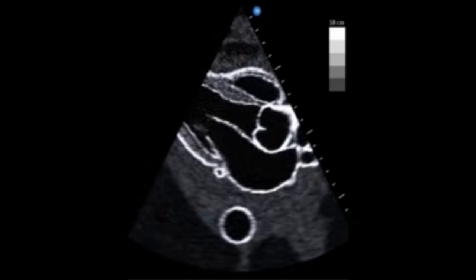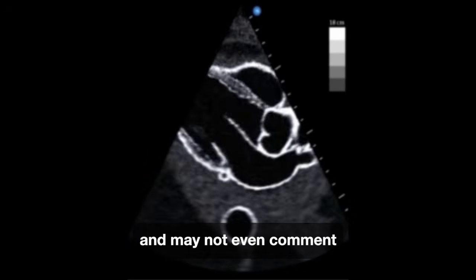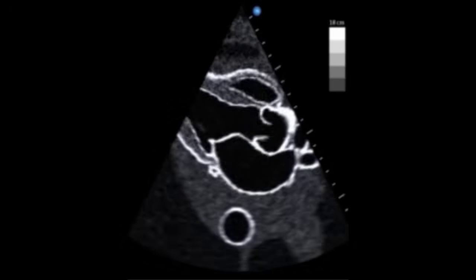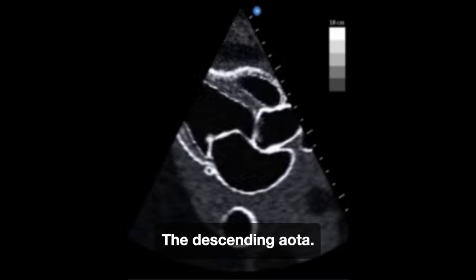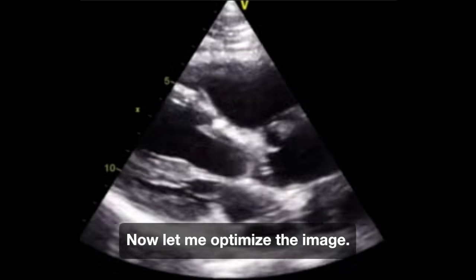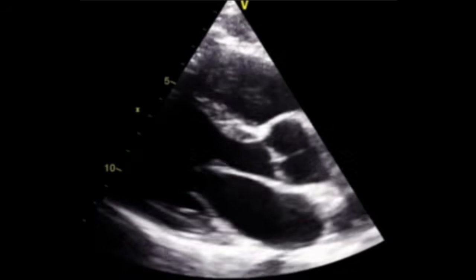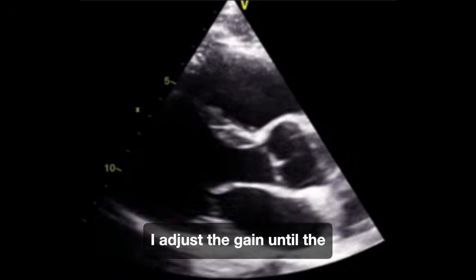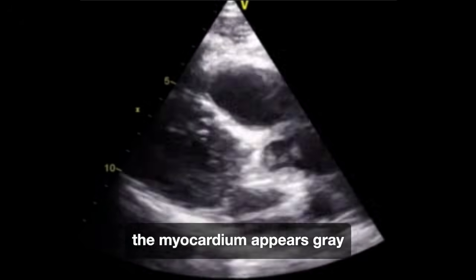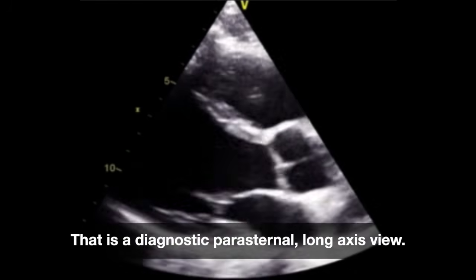A question for you. Of everything visible on this screen, which structure will I not measure and may not even comment upon, but will never leave this view without identifying? The descending aorta, and I will show you why shortly. Now let me optimize the image. A small heel-toe movement centers the ventricle. I reduce the depth. I adjust the gain until the blood pool appears black and the myocardium appears gray rather than bright white. That is a diagnostic parasternal long axis view.